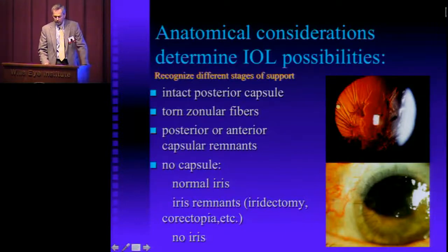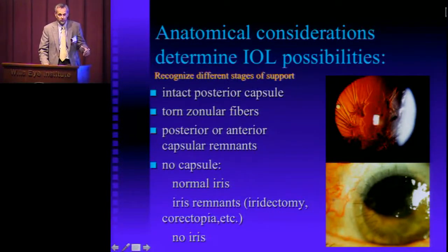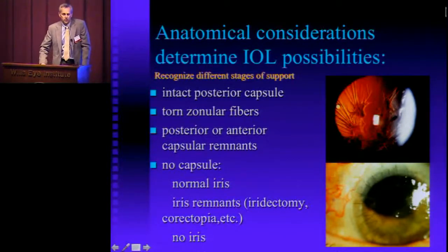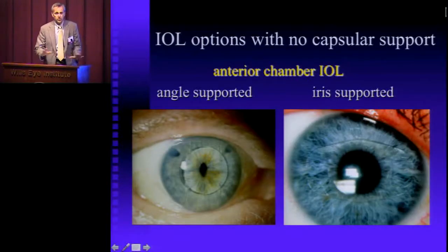In the case of dislocated lenses, you really need to take the lens out. It's a little bit hard to suture in a lens because frequently that compounds the problem if the lens is already dislocated. In a way, there was a former governor of Kentucky that said there's no educational value the second time you get kicked by a mule. So if a lens has been dislocated or lost or out of position, then frequently you need to start over again and get it placed in the right position.